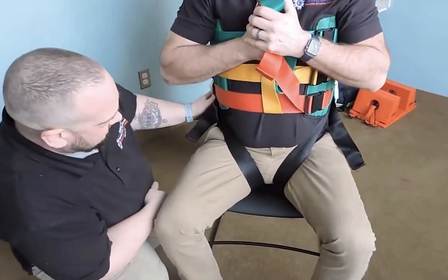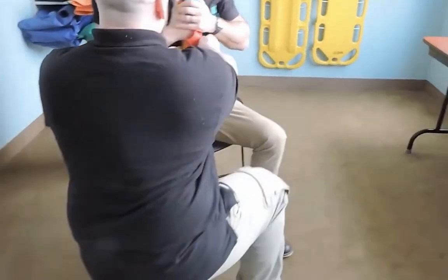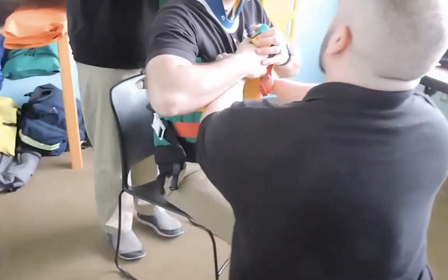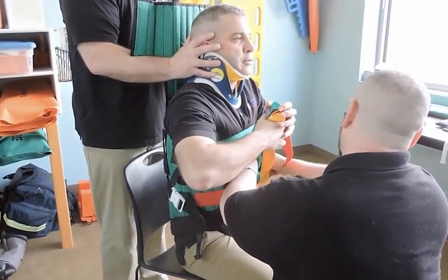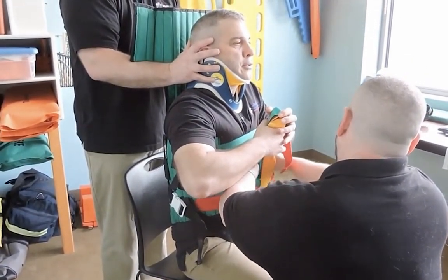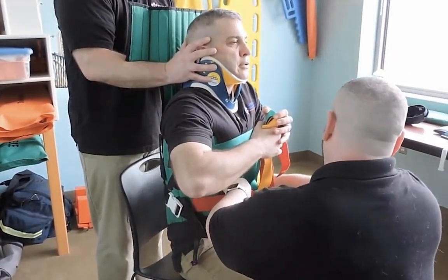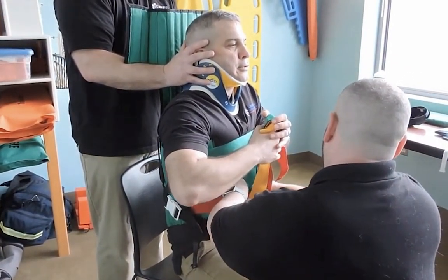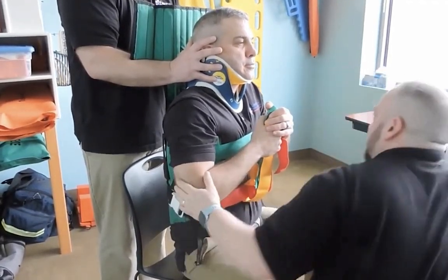So now that we have these secured, we'll go back and make sure they're nice and secure. Sir, I'm going to have you take a nice deep breath for me — breathe out. I'm going to secure these. Nice deep breath, then exhalation — just make sure it's snug. One finger breadth. One more deep breath for me, sir. Okay. So now we have these secure — one finger breadth — and you can relax, sir.